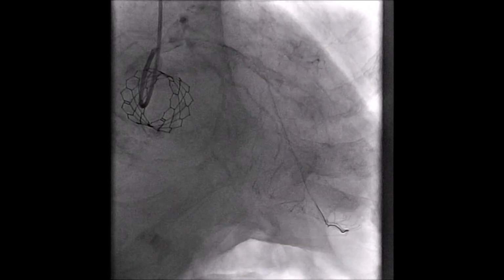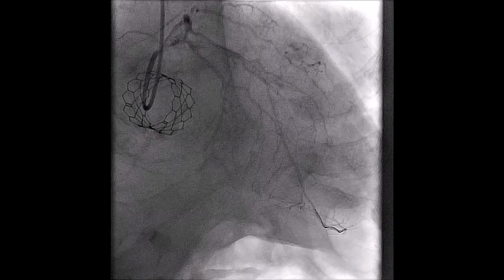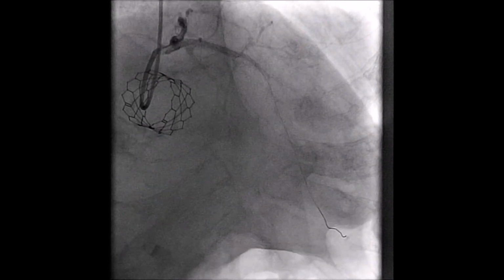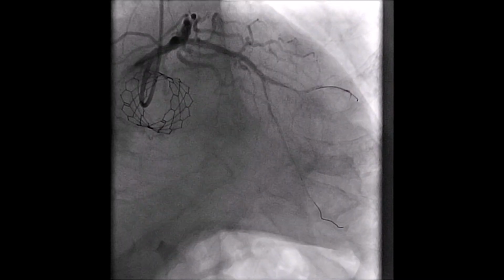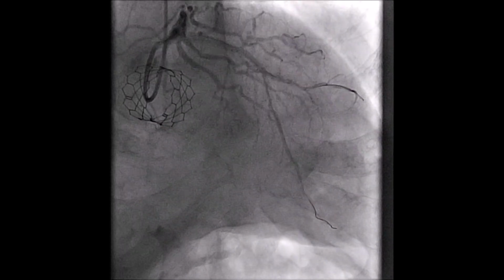Thus, it was possible to open the main artery, and it was observed that the disease extended to the middle anterior descending artery and the first diagonal branch, which, in fact, was still closed. For these reasons, a guide wire was advanced to this branch and the vessel was predilated, managing to restore blood flow and showing that this branch had modest caliber and development.